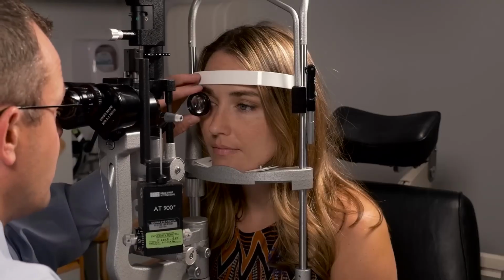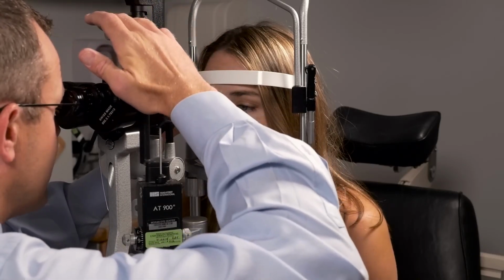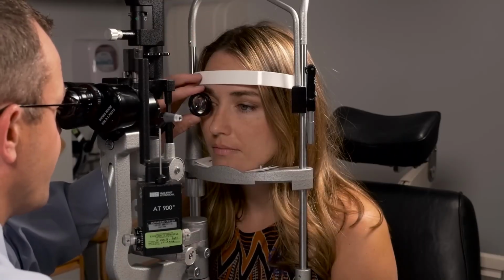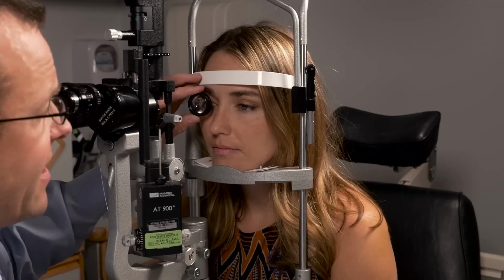So first things first, now that I've got the nerve and the macula in focus, I'm going to narrow the beam, shorten it, widen it just a hair. First thing you do when you look in the back of the eye is to look at the nerve of the eye. You'll look at the size, you'll look at the optic cup, and you'll look at the borders of the nerve, and you'll look at the blood vessels coming out of the nerve.